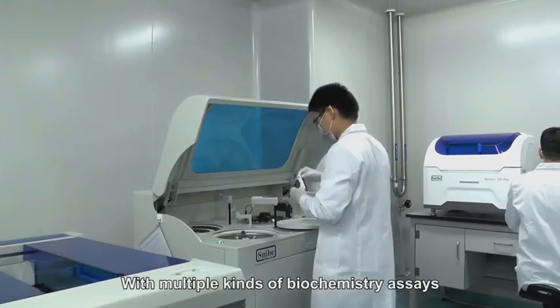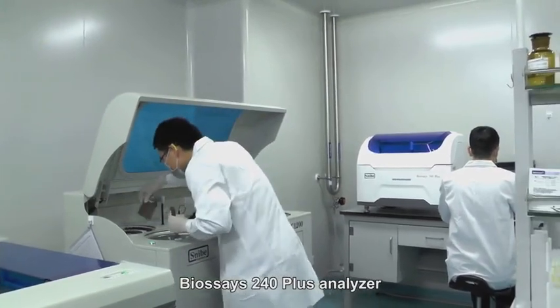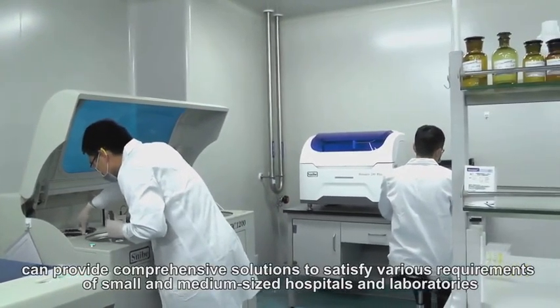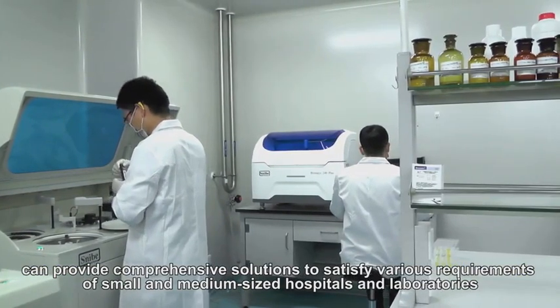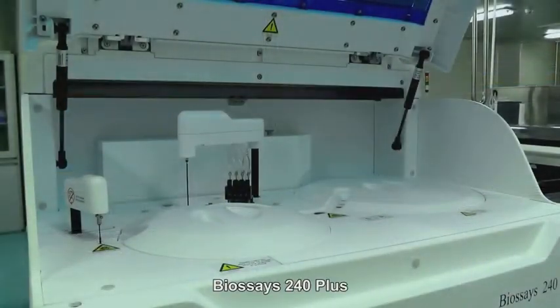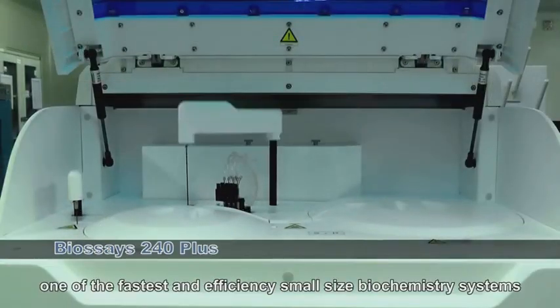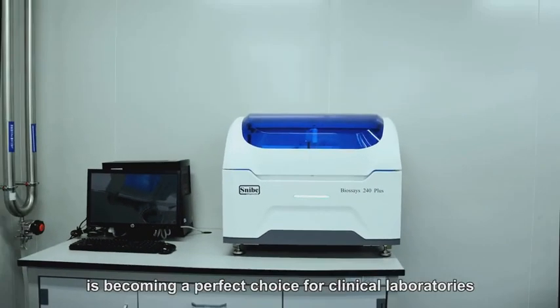With multiple kinds of biochemistry assays, BioSage 240 Plus analyzer can provide comprehensive solutions to satisfy various requirements of small and medium-sized hospitals and laboratories. BioSage 240 Plus, one of the fastest and most efficient small-sized biochemistry systems, is becoming a perfect choice for clinical laboratories.